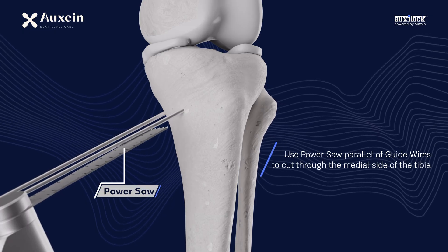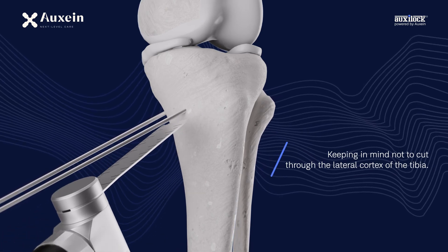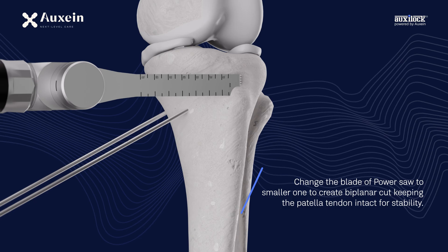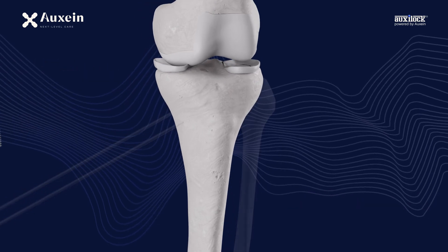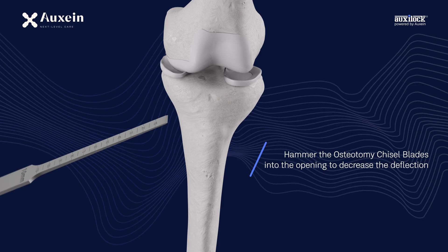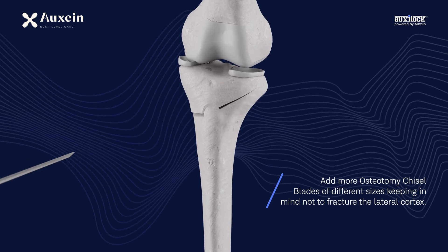Use a power saw parallel to the guide wires to cut through the medial side of the tibia, keeping in mind not to cut through the lateral cortex. Change the blade to a smaller one to create a biplanar cut, keeping the patella tendon intact for stability. Hammer the osteotomy chisel blades into the opening to decrease the deflection, adding more chisel blades of different sizes while avoiding fracture of the lateral cortex.